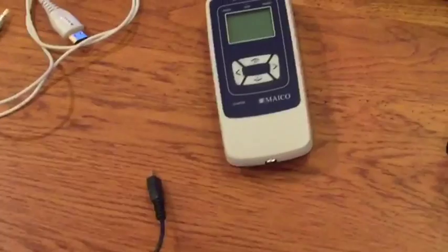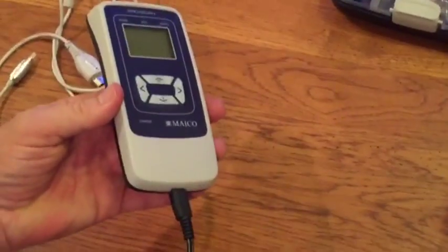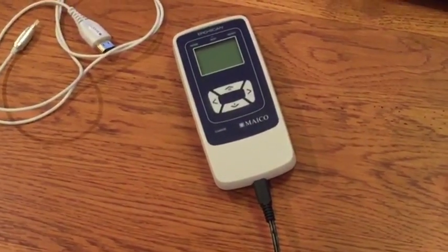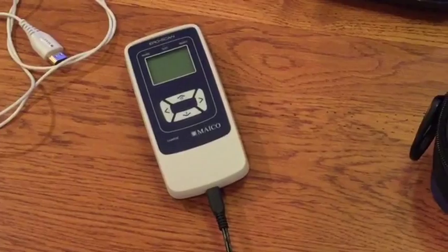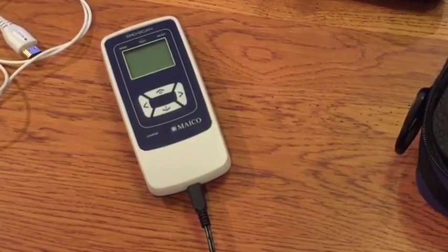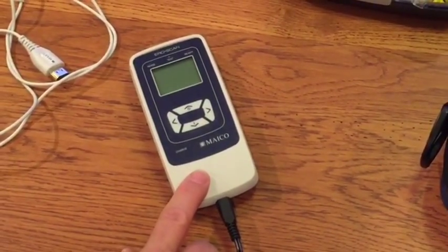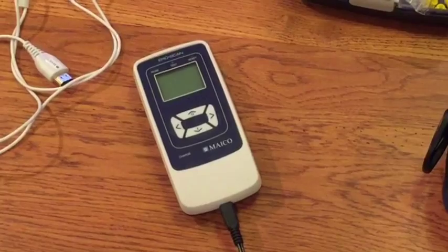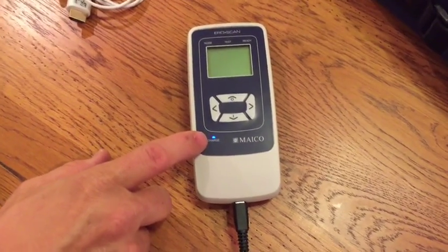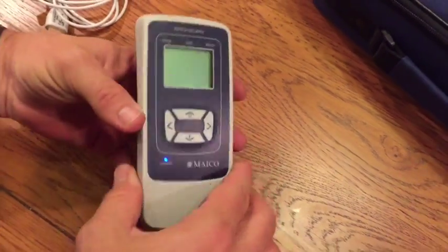The first thing you'll need to do is charge the unit. Plug the charger into the unit, then plug it into a wall outlet and let it charge. It takes about three to four hours to fully charge the rechargeable battery. Once charged, you'll get about a thousand tests or about 20 hours of testing before it needs recharging. It's important not to fully deplete the battery — charge it when five to ten percent of battery life remains. When fully charged, the blue charge light will come on and blink, indicating the unit is ready.